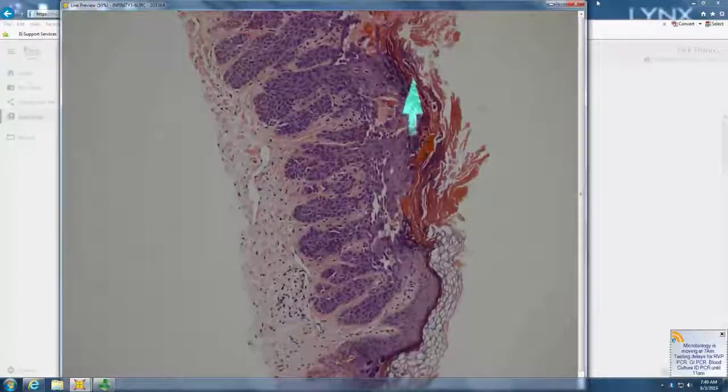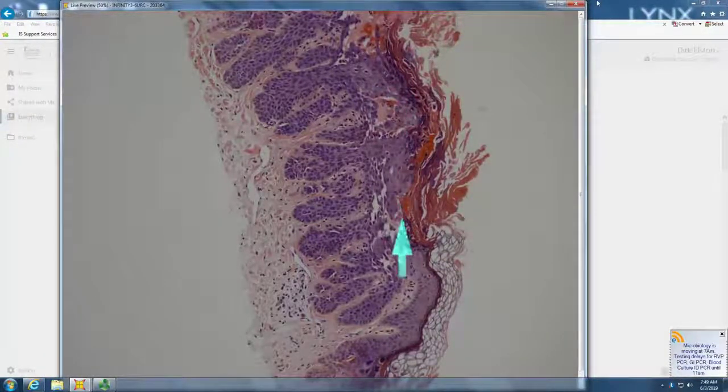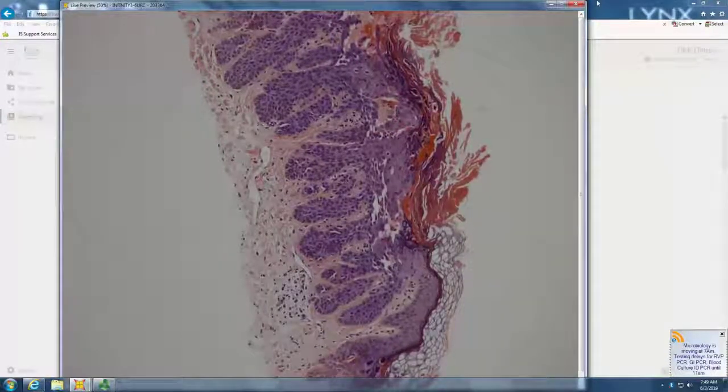The crust with some acantholytic dyskeratosis. So you have a crust and acantholytic dyskeratosis, clefting. So what's your differential for acantholytic dyskeratosis? Darier's disease, warty dyskeratoma, Hailey-Hailey. So Darier's, warty dyskeratoma, Hailey-Hailey.